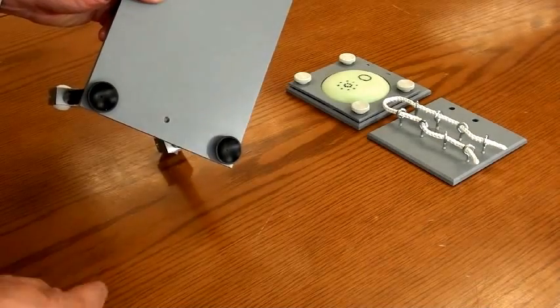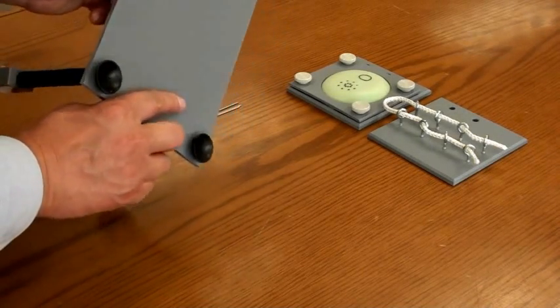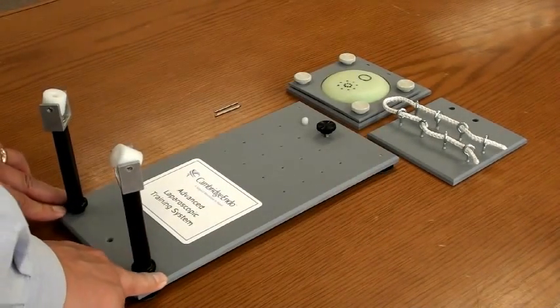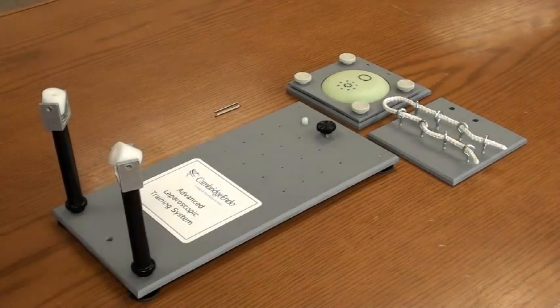Notice the bottom of the baseboard — it has four suction cups for feet. By pressing down the baseboard on top of a smooth surface, the training system can be securely mounted for ease of use.